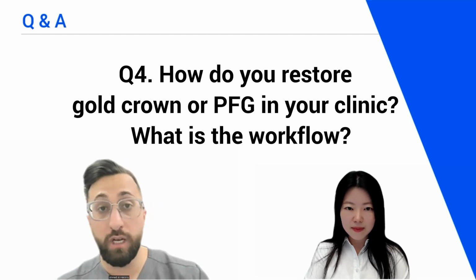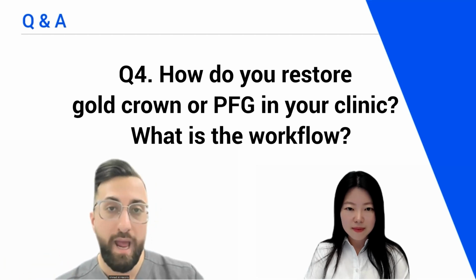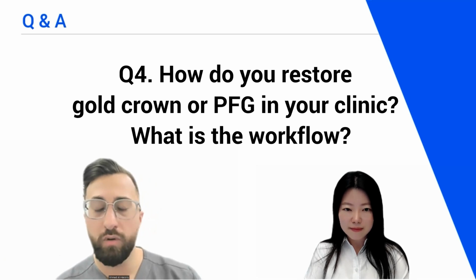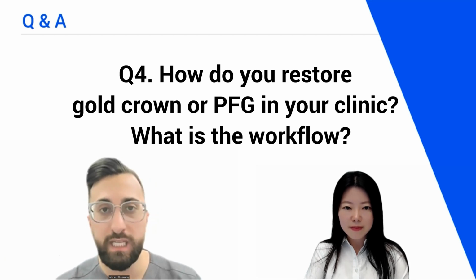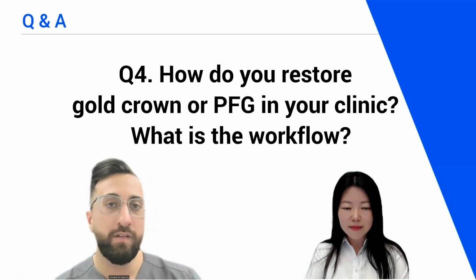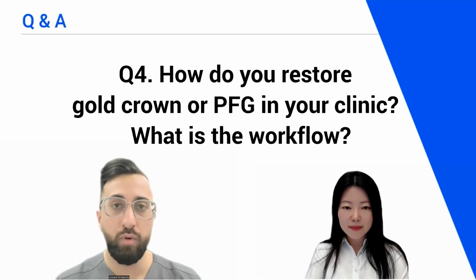I know there's a lot of digital labs out there that still do gold. And if they don't do gold, they can make a wax up digitally and they can print that wax up out of a resin that can be basically casted or burnt out into a gold crown. So treat it exactly the same as all your other crowns. If you're doing it in-house, you won't be doing gold in-house because very few clinics have the equipment needed to make cast gold crowns. But if you're sending it to a lab, you just treat it as normal. No difference. Just make sure on the lab form, you select gold and the lab will be able to handle everything else.